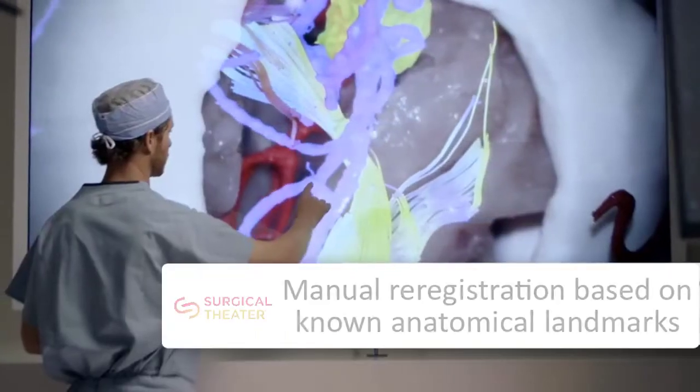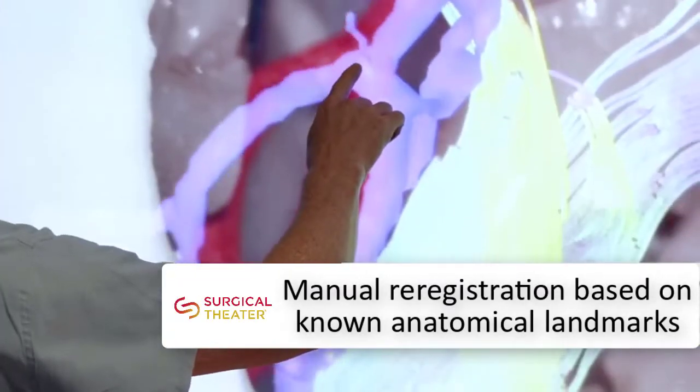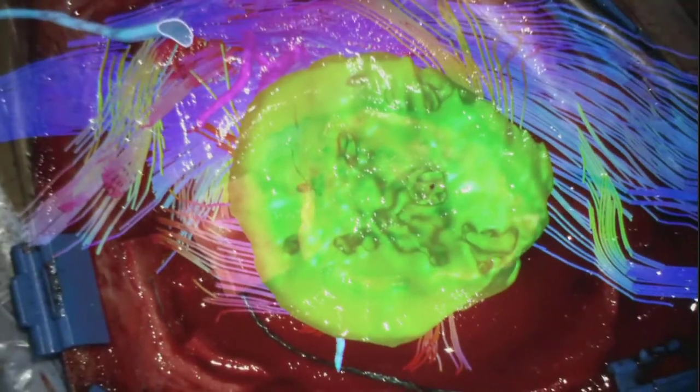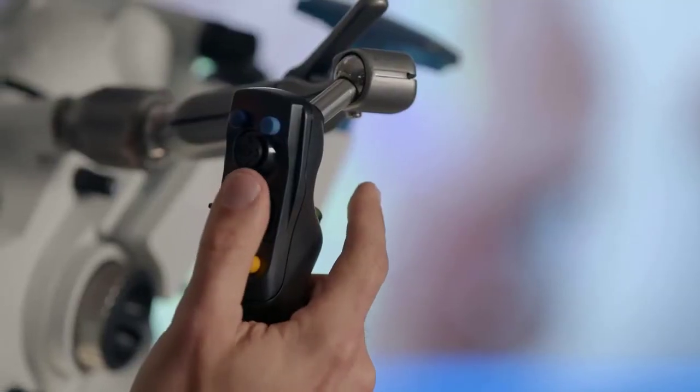If a shift in navigation occurs, intraoperative re-registration is done using known anatomical landmarks for manual realignment. The scale and alignment of the AR overlay remains accurate even as the microscope is repositioned.